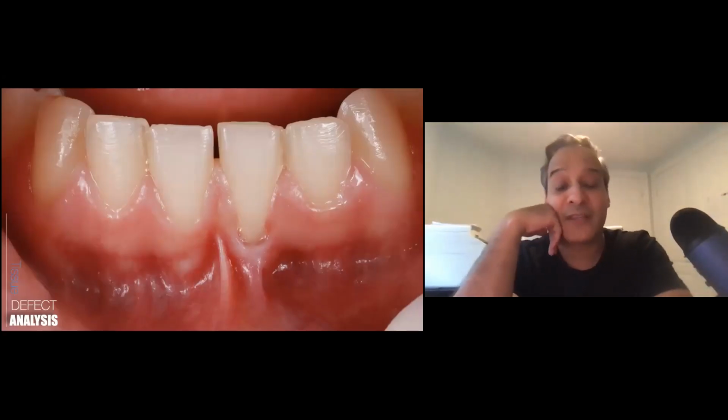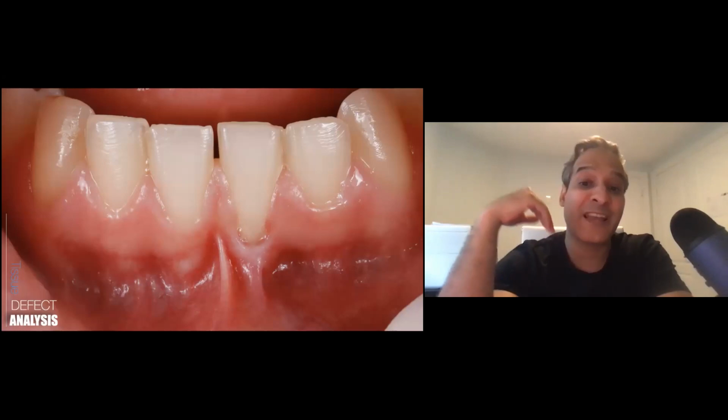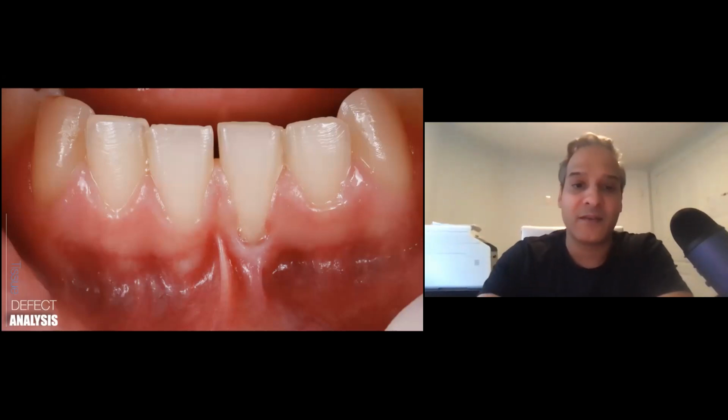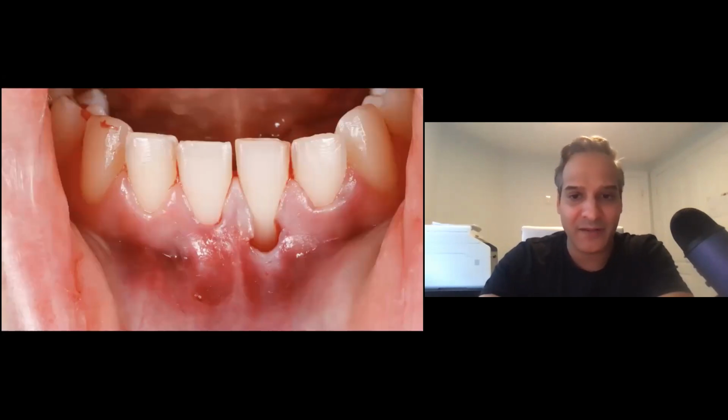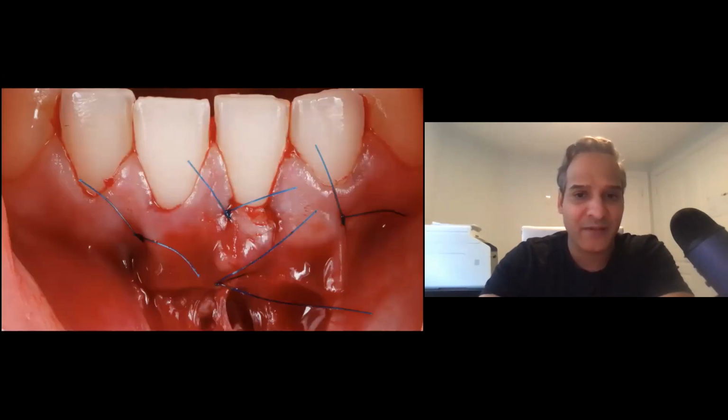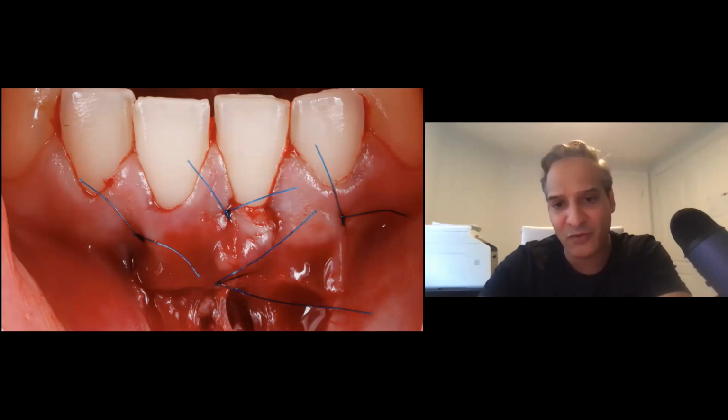Here's a lower anterior case. Now here you can see the frenum is attached right onto the gingival margin. So whenever this is the case, we need to release that pull. Sometimes I create my tunnels, measure our graft in, secure the graft, position it, and then I do an apical incision. So you can see I have an apical mattress suture to hold the graft in place, and then apical to that, I make a small incision just to release the vestibule and the tension on the flap.